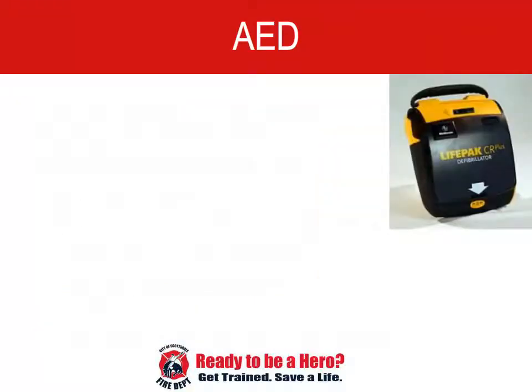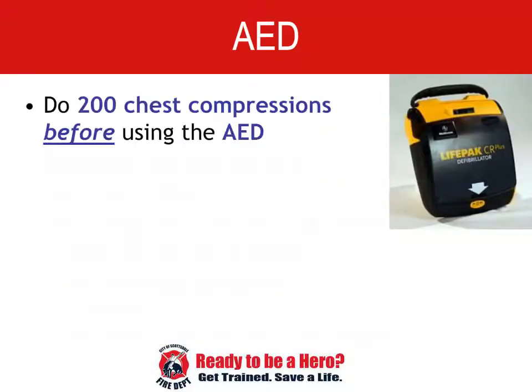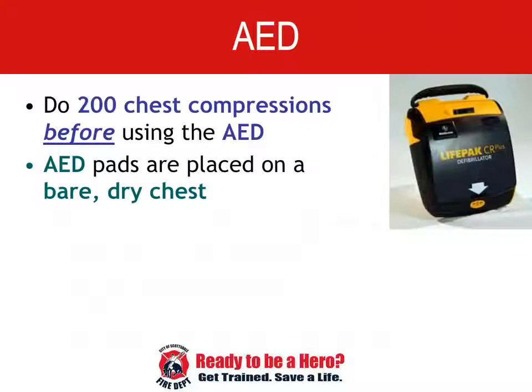We need to do about 2 minutes of compressions before using the AED. Remember that someone else should be getting the AED. By the time they grab the machine and set it up, you will have completed about 200 compressions. The pads need to go on a bare, dry chest.